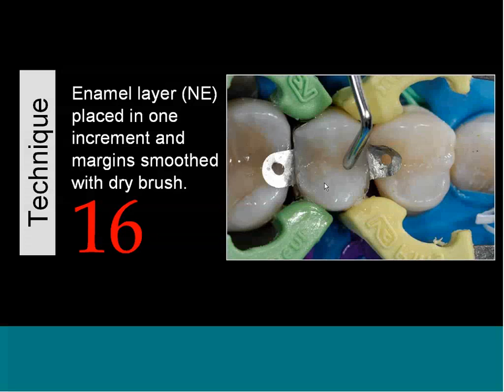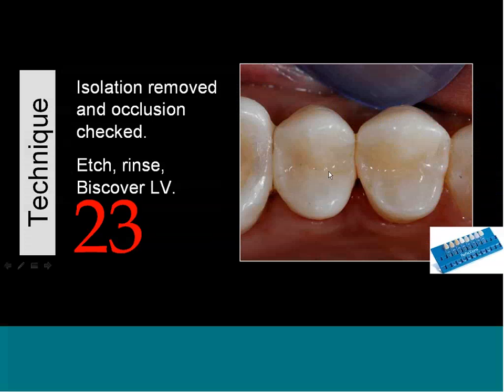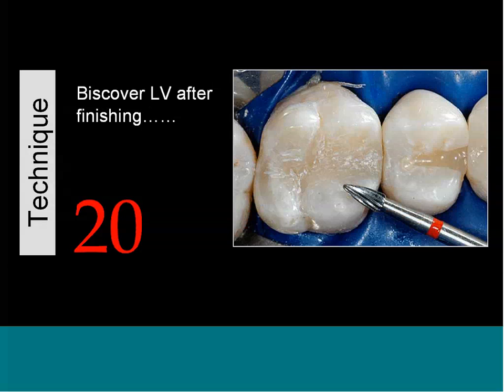So these are the restorations after. So we're going to take off the rubber dam, check the patient's bite, and we're going to etch, rinse, and then apply Biscover LV, the sealer, over any areas I may have damaged when I finish the restorations. So in this case, we have a nice color match. So here's an example of dark dentin, again with neutral enamel. This is a younger patient. For, let's say, a more mature patient, lean towards the gray enamel, and I'll show you one case in a minute here I did with the frost.